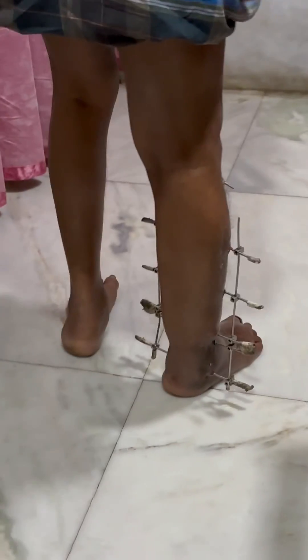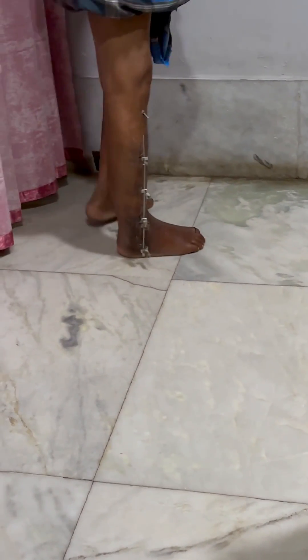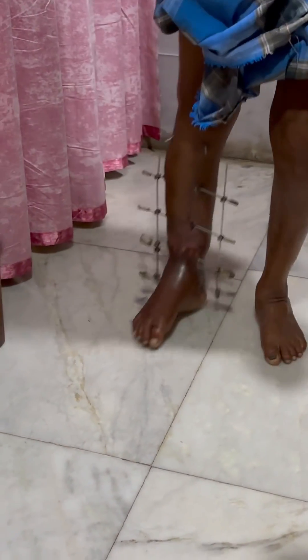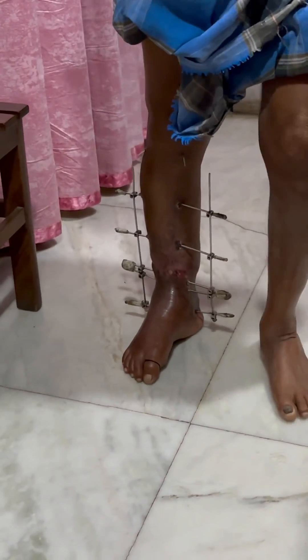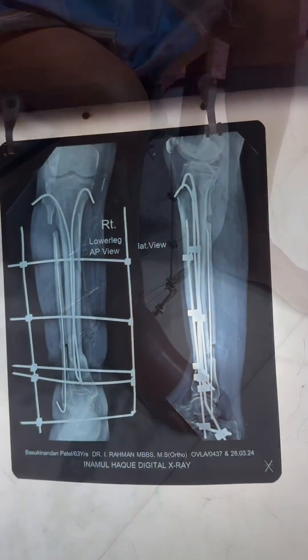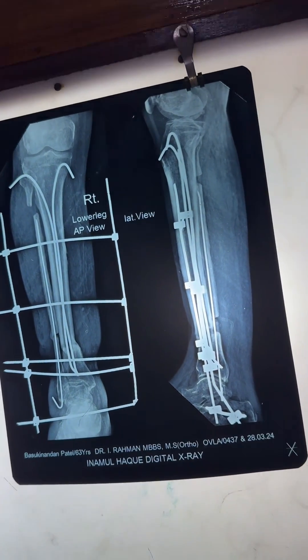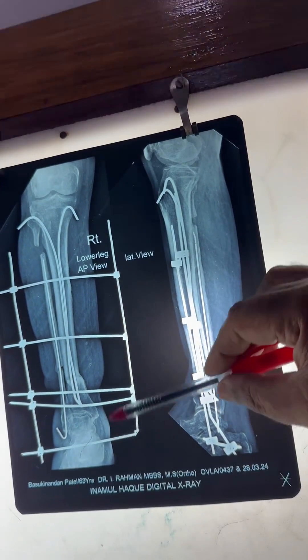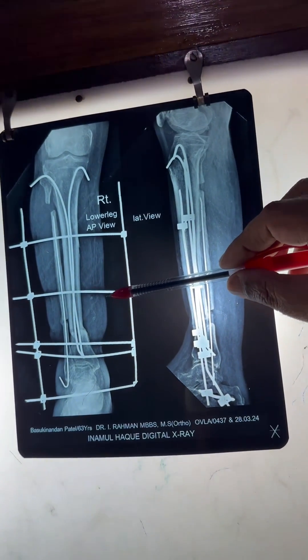One of the best methods to counter bone gap where compounding is present — this is the low-cost method of treating patients with tibia-fibular injury where there is exposed bone and loss of bone compounding. One can see how this fracture got united with this compression external fixator.